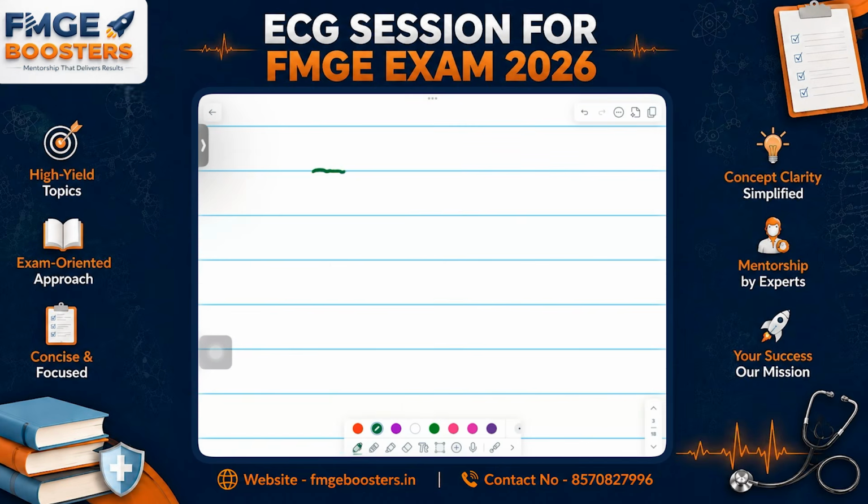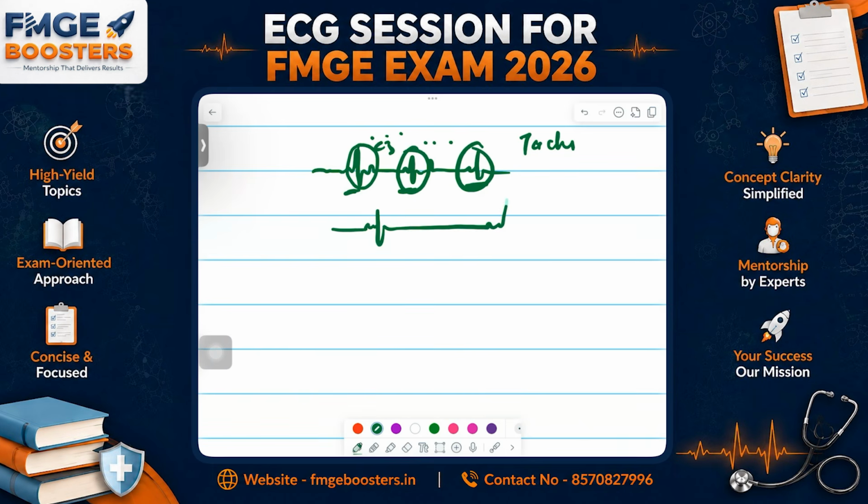If the large boxes, let's say PQRST, PQRST, PQRST, are less than 3, the complexes are coming soon, right? Do you see the complexes coming soon? The large boxes being less than 3 means it is tachy. Now, if it is again more than 6, tell me, is it tachy or brady? This one is brady. Understood, guys?